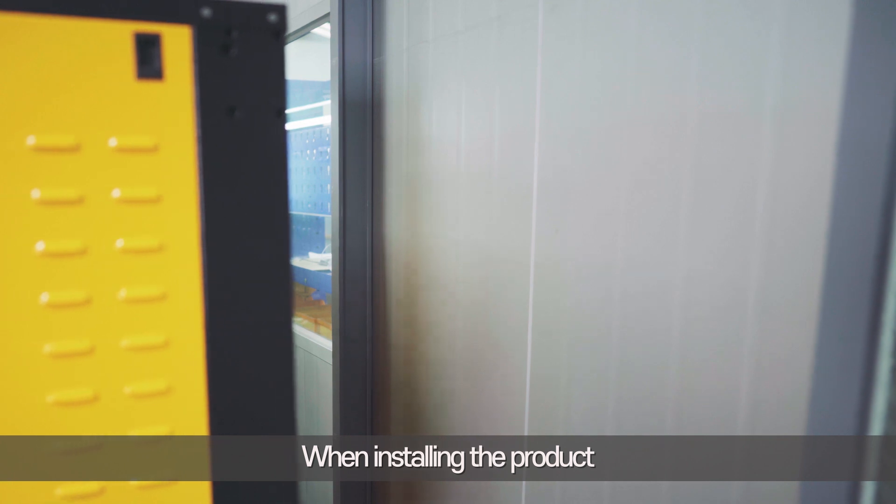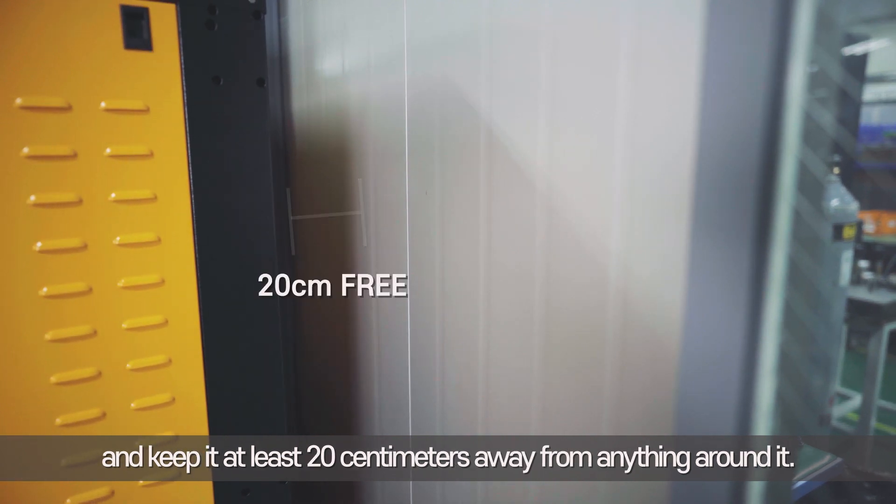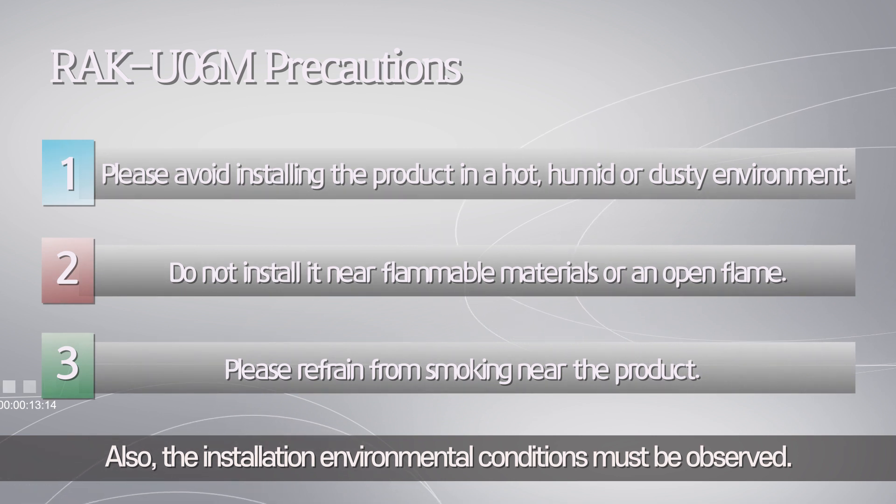When installing the product, make sure that there are no obstacles in the intake and outlet vents, and keep it at least 20 centimeters away from anything around it. Also, the installation environmental conditions must be observed.